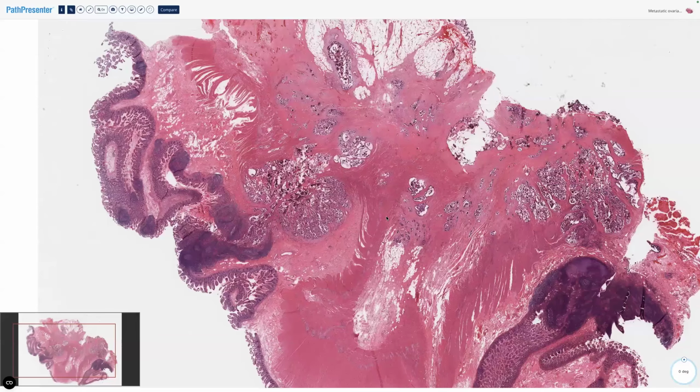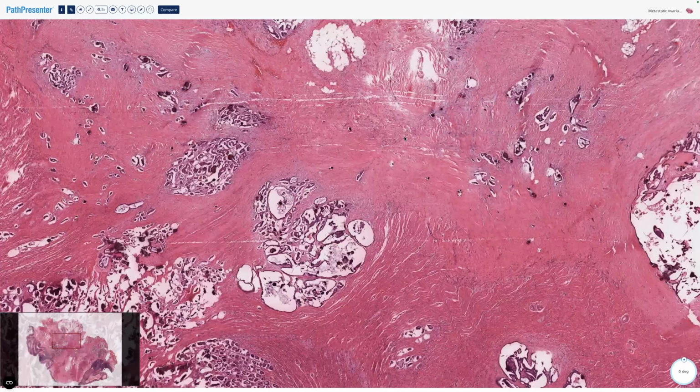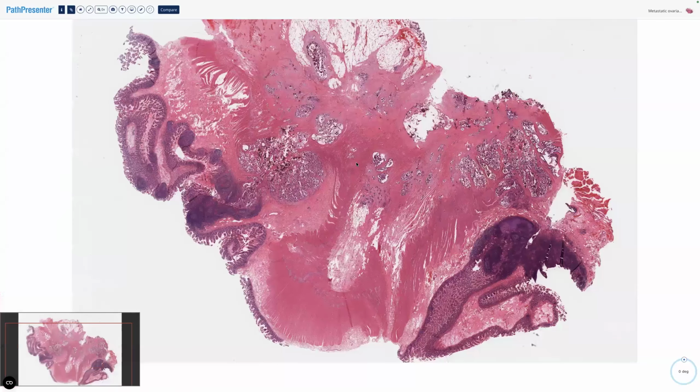The second one is like this, where there appear to be large areas of fibrous tissue, plus or minus macrophages, and this looks like it's had some response, so it's a 2. And then there are the ones where you're hunting around to try and find tiny bits of tumor, and they have complete or almost complete response. So remember, impress your consultants by saying, and I have graded the response to the chemotherapy. That means you do have to look up whether they've had chemotherapy. But usually by the time you get this, they have.